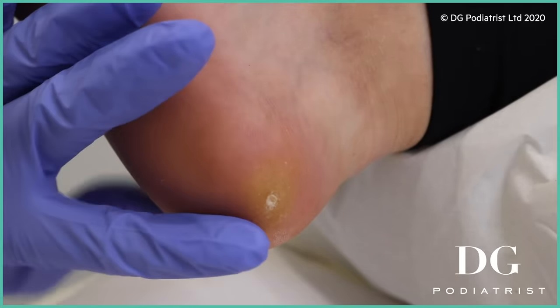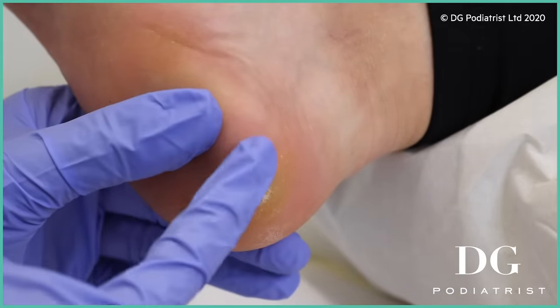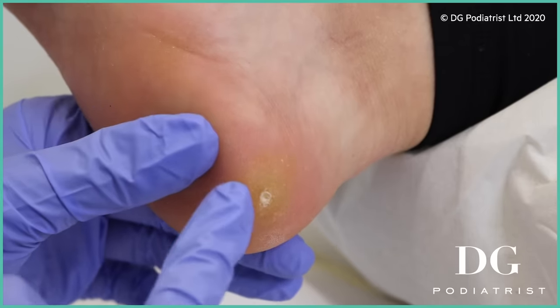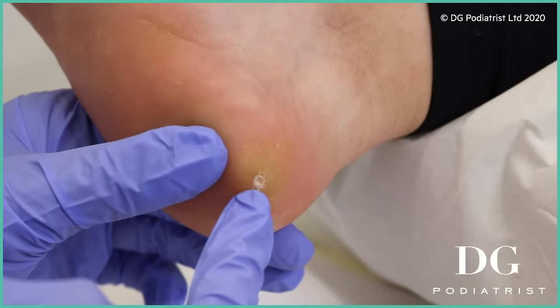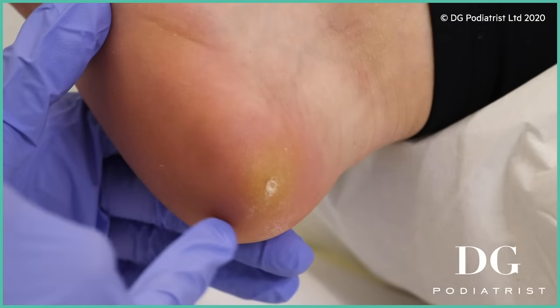So this looks incredibly painful. I'm not sure if you can see very clearly on the camera, but there's a bulge here because the soft tissue is so inflamed from the pain. You've got the hard skin sitting there and then the corn, which is at the center part right there in that region. You can see the redness encompassing on the side there.